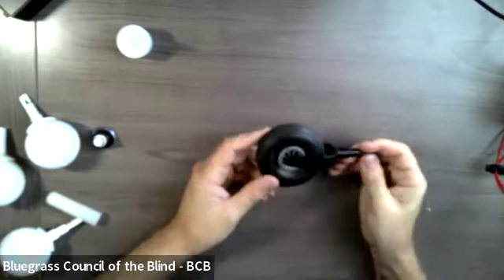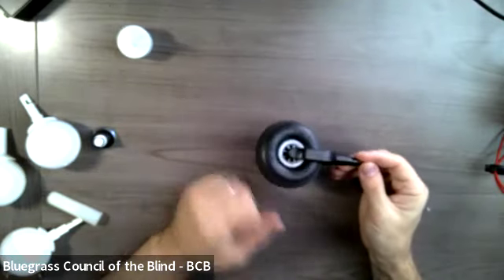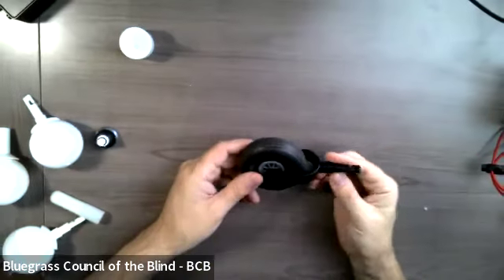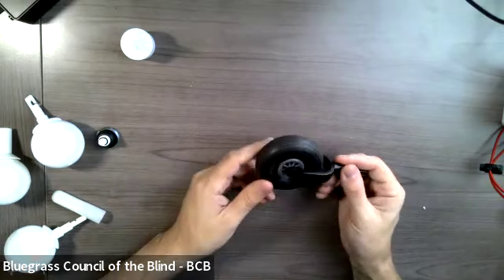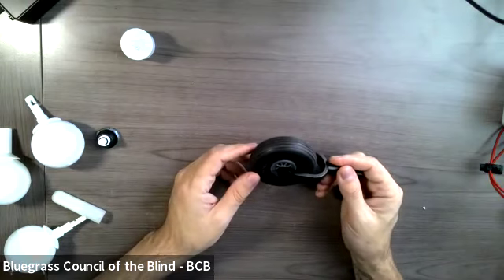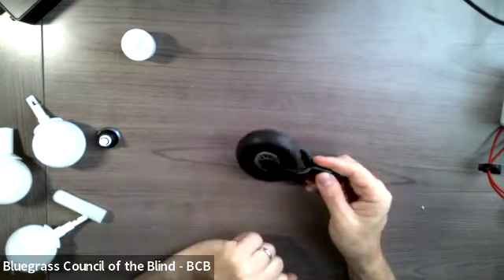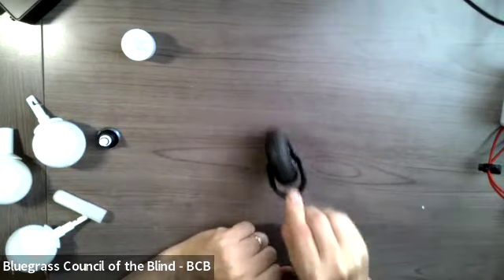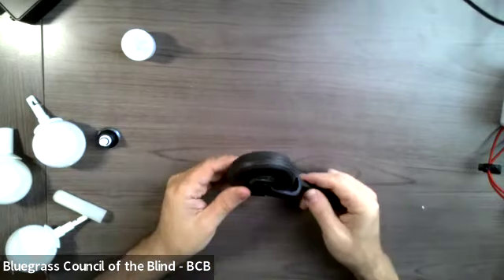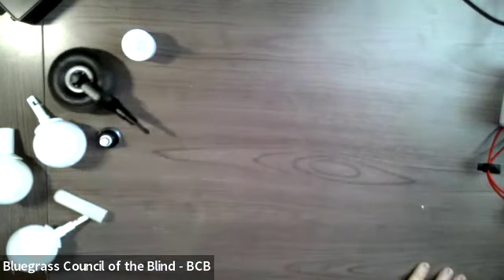Here is a very strange tip. This is a rolling wheel tip. It's just a wheel at the end of a hook style tip, and kind of reminds me of a wheelbarrow wheel. If you took the wheel off of a wheelbarrow and put it on the end of a tip, that is what you're going to have here, the rolling wheel tip. And it just kind of rolls out in front of you. Very interesting tip, very unique.